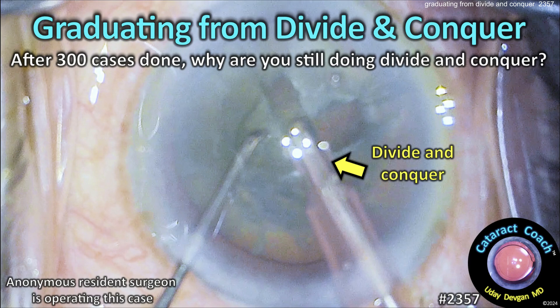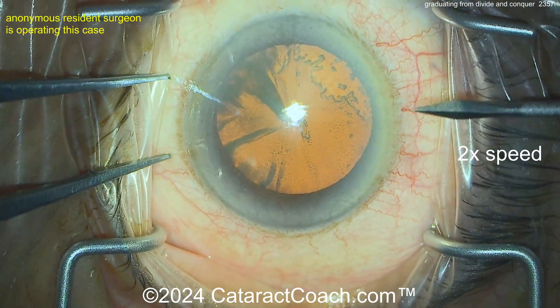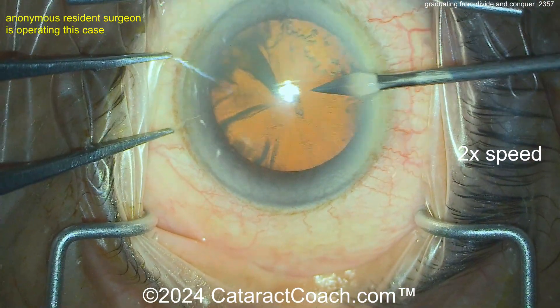Cataractcoach.com — graduating from divide and conquer after 300 cases done. Why are you still doing divide and conquer? Now this is an anonymous resident who's going to do a great job here. Watch the video — about 300 cases done.